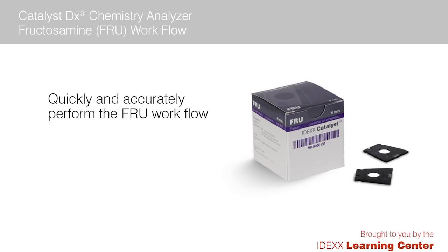In this video, we will demonstrate the proper way to run a fructosamine slide on your Catalyst DX Chemistry Analyzer. As you'll see, the process for running fructosamine is the same as most other Catalyst slides.